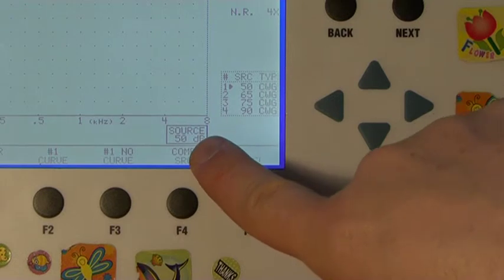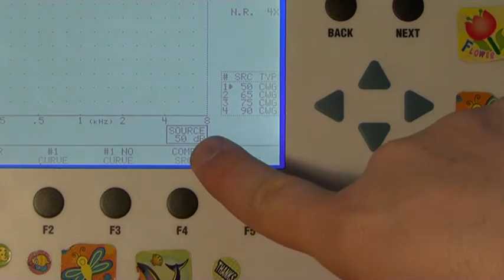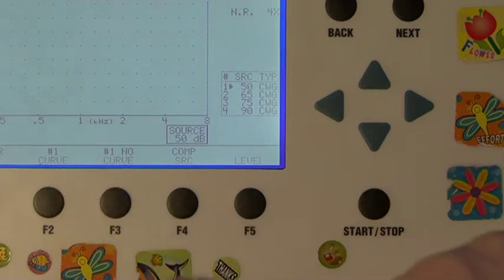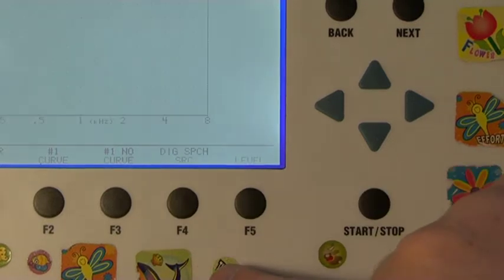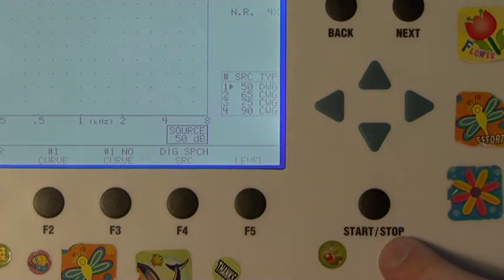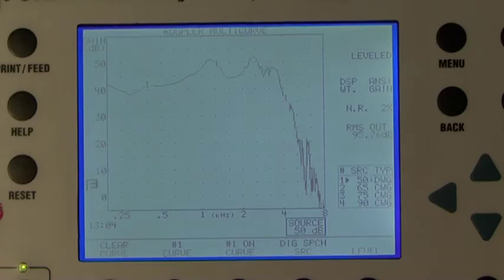The initial source should be 50 dB. If not, press the Up and Down arrow keys to adjust the level as necessary. Above the F2 button on the screen should read Curve 1. If not, press F2 repeatedly until Curve 1 is shown. Press the Start-Stop button to start the first response curve. A response curve should be displayed in real time and you should allow a few seconds for the curve to become stable.